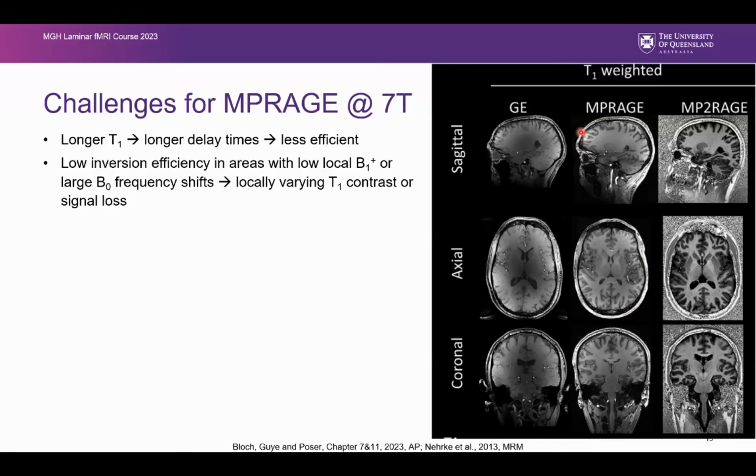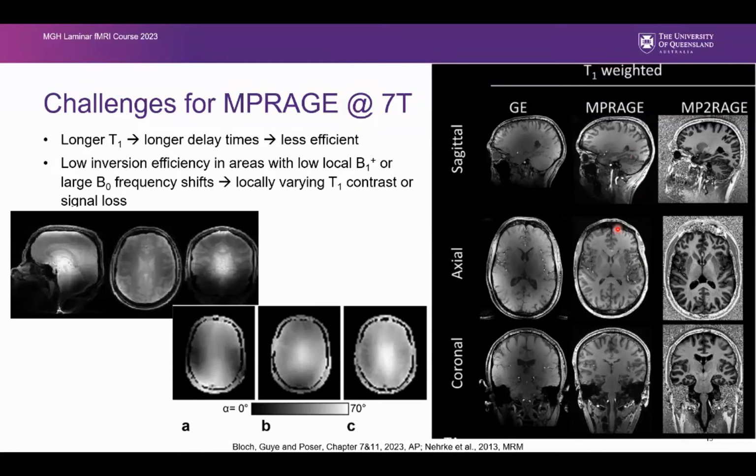And you can see if you run an MP-RAGE image on the 7T, that doesn't really work anymore. So here at the front, we have some really bright spots. And if we zoom in, you've seen it on the slides a couple of times, B1, but basically because the frequency goes up, we have constructive and destructive interference of the RF pulses. And one of the first images acquired on a 7T looked something like this.